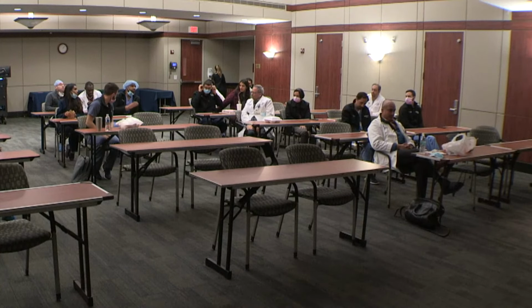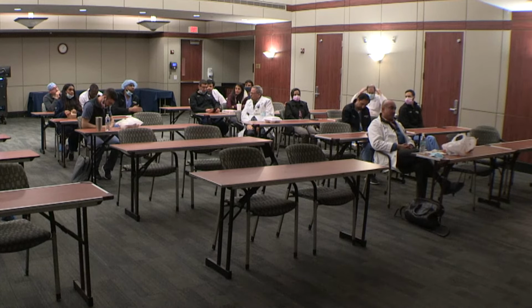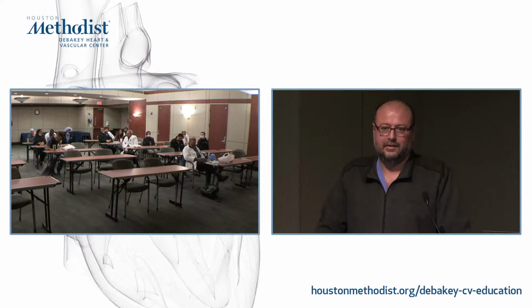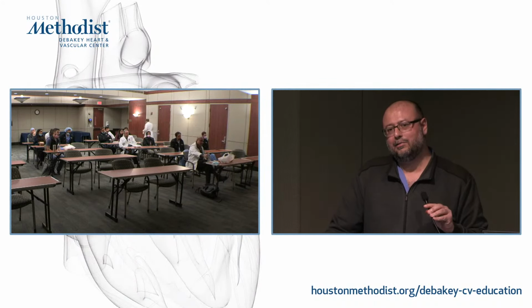Any questions? Yes. My question is, with a good quality echo and a high clinical suspicion for amyloid, specifically ATTR, is there room to just go to PYP without MRI? So, MRI is going to, first of all, confirm your diagnosis.